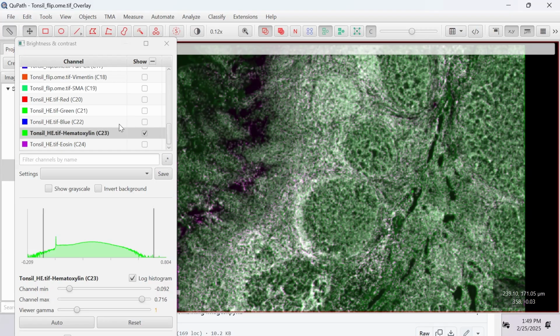So by taking your fluorescence image first and on the same slide, creating an H&E slide on the top of that, or creating some collagen staining on the top of that, you can maximize the amount of information you can harvest from that sample. Needs to be done on the same slide if you want to make your life easy. Because only doing this on the exactly same slide gives you the ability to look at the same actual cell.